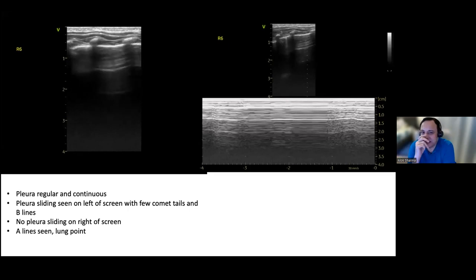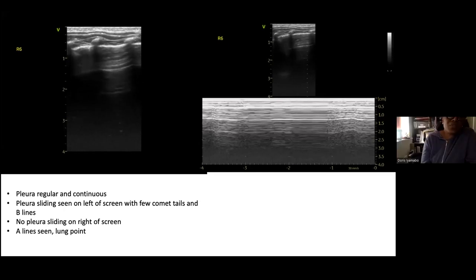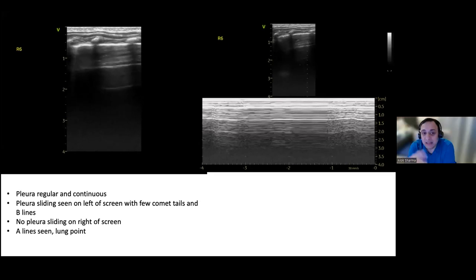My only worry is that your baby is supine. It would be very unusual. Was your baby prone at this point? No, she was lying lateral, so I could do the scan. Even if she's lying lateral, then your R3, R4 would definitely have air. You might have an air bubble at R6 as well. It's definitely possible. Yeah, I mean, I moved her.